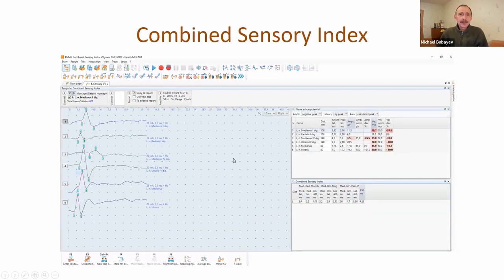Combined sensory index is not an additional technique, but an additional test template in sensory conduction velocity. This template is useful for carpal tunnel syndrome. It is necessary to record six traces from different nerves - medianus, radialis, and ulnaris - and then calculate three differences: for example, medianus-radialis thumb difference, and so on. The sum of these three differences is the combined sensory index. In normal subjects, it should be lower than 0.9 milliseconds.